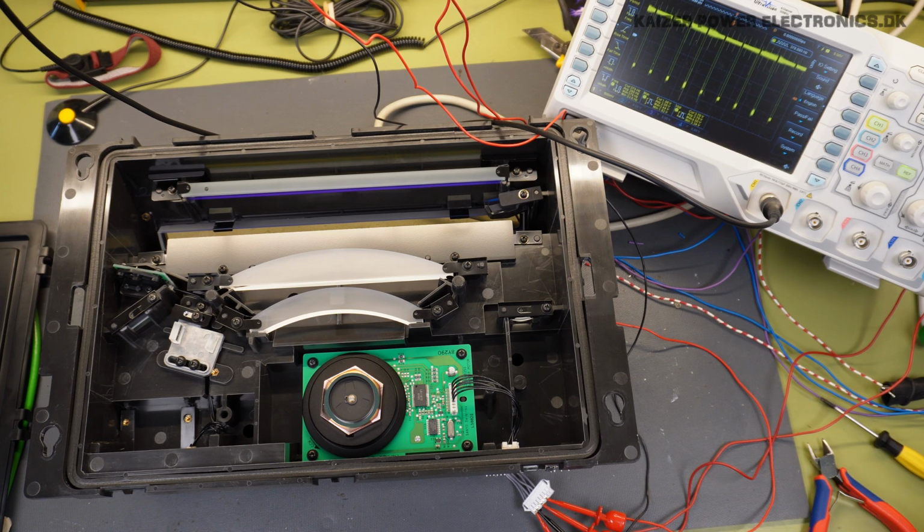So let's just try to turn on the power supply. And yeah, nothing really happens. Try to change the drive frequency. No, not really doing anything. It is supposed to be driven with a falling trigger, so it is correct pulsing, but we can also try the opposite one. Yeah, that doesn't really change a thing.